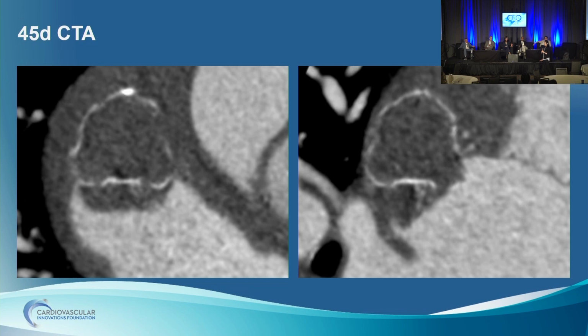She's had a prior stroke, thrombus on the device, bulky. Do a TEE first, and then see how big it is, and the options, whether you want to do something about the thrombus. If it's located just like what the CT shows, it's something we could do, like a mini AngioVac or something, and then full dose, something like that, or I'd love to see the TEE first. I would do full dose. Yeah, full dose. Full dose Eliquis, so nobody for warfarin? No, there's no advantage.